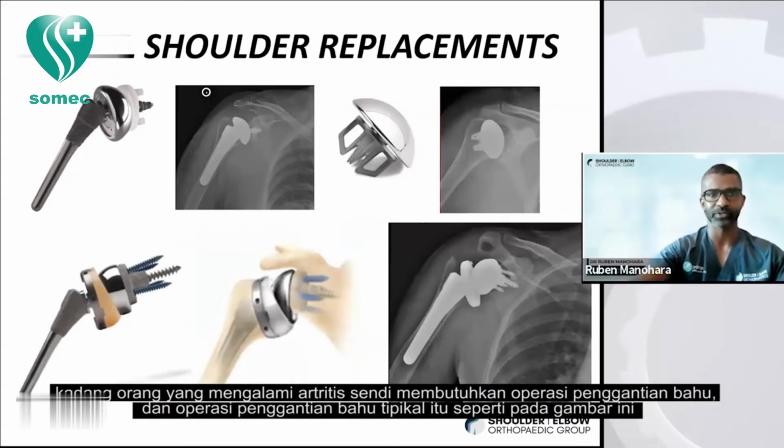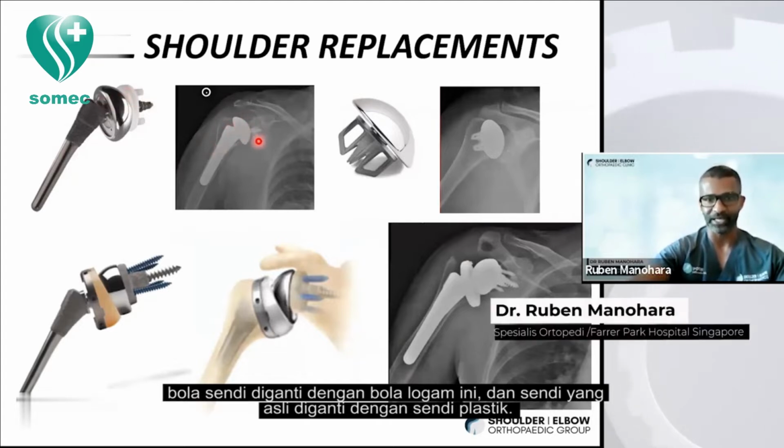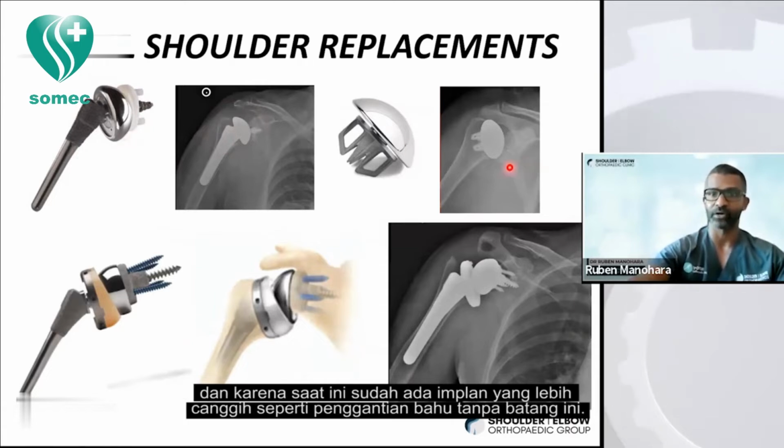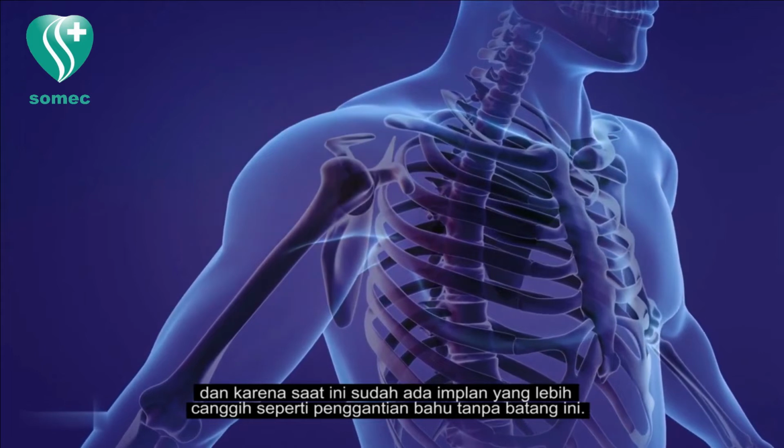And the typical shoulder replacements are like this picture here. You know, the ball is replaced by this metal ball and the socket is replaced by this plastic socket. Nowadays, we have even more high-tech implants. This one is a stemless shoulder replacement.